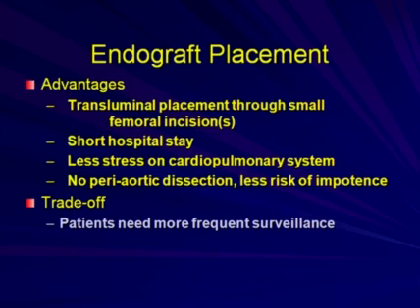The advantages of an endograft placement over open repair is that it's transluminal, small femoral incisions, the patients have a shorter hospital stay, there's less stress on the cardiopulmonary system, and there's less risk of impotence for the men because there's no peri-aortic dissection. However, there's a huge trade-off for these advantages, and that is that patients need more frequent and lifelong surveillance. We don't know what the long-term efficacy is.